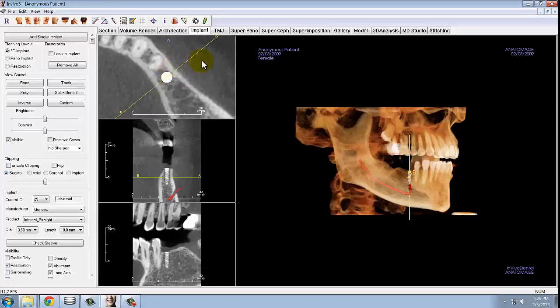You need to have this AB line at the crest because this determines which axial slice is shown. When determining how much space there is for an implant between adjacent teeth, you are interested in the space at the crest. You want to have at least 2 mm between the implant and adjacent tooth.